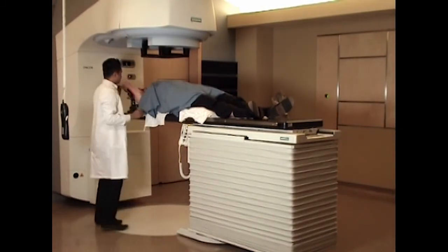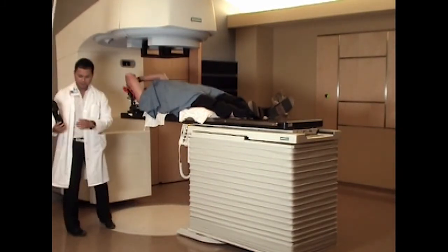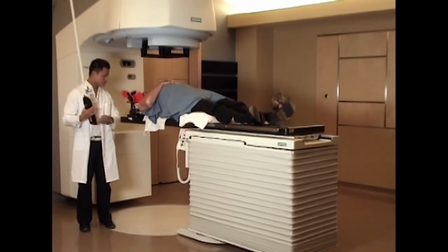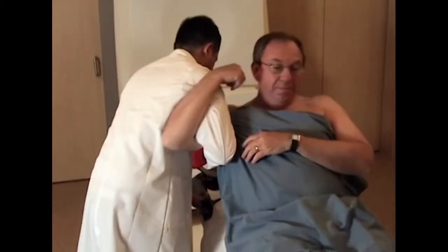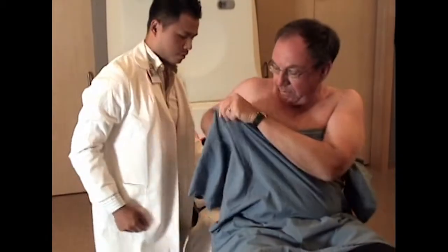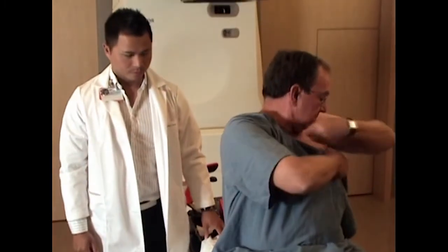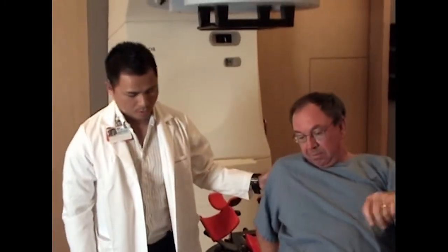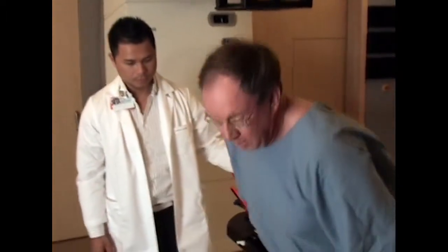During the course of treatment, various side effects may be experienced. Therefore, it is important for us to continually review your status. Your radiation therapist will speak with you during each session to see if you are experiencing any side effects. Once a week, you will meet with your radiation oncologist and primary nurse to review and monitor your progress.